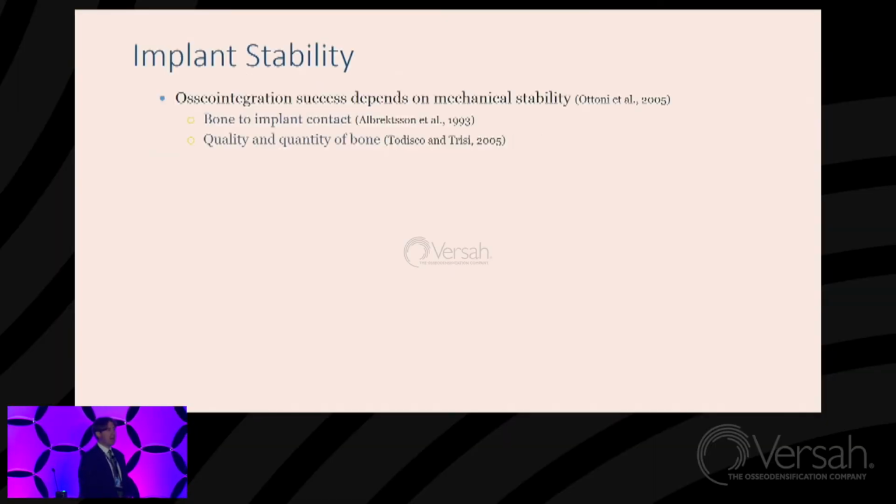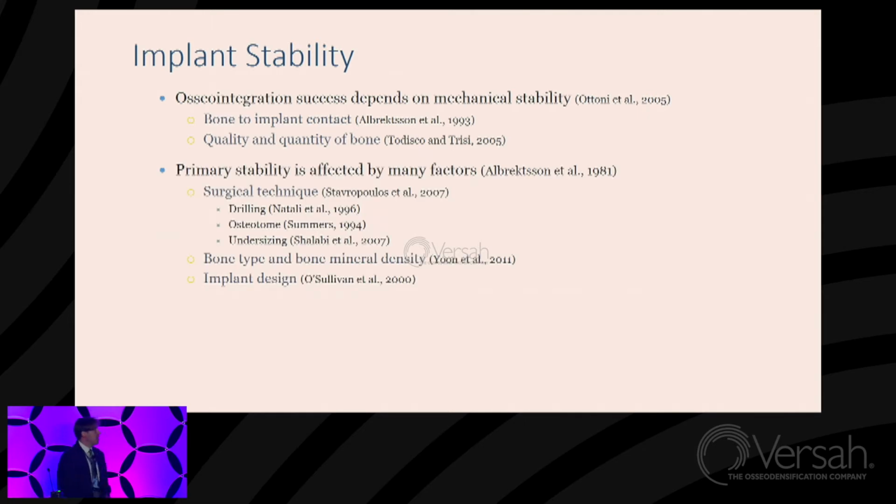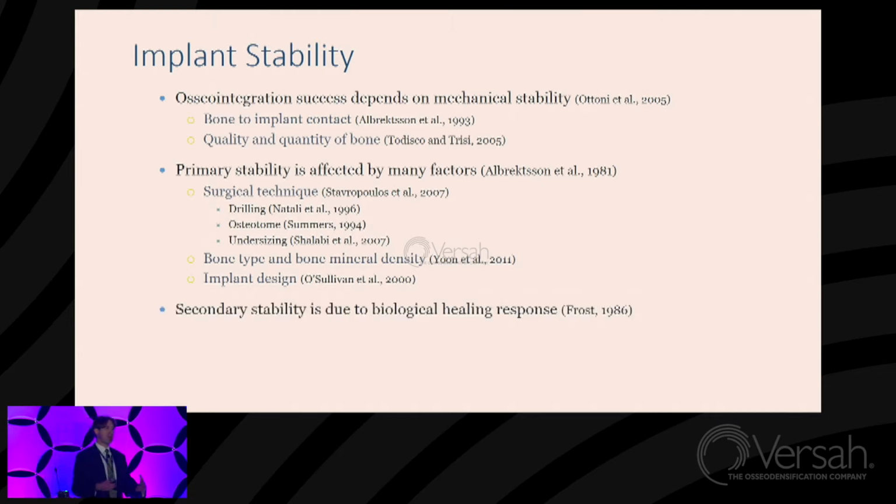He introduced a lot of the background, so I'm not going to spend a lot of time on the clinical aspects of implant stability. That's really not my area of expertise anyway, but just be aware that this has a long history in the scientific literature. Mechanical stability, as you have heard, comes from the initial biomechanical factors that are influenced by these 6 different parameters, of which, for our purposes, we're more interested in the 3 shown here, as well as the long-term healing response. So really, it's a combination of mechanical and biological factors that are required for successful implant osseointegration.